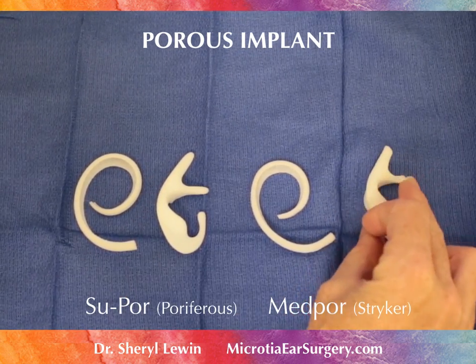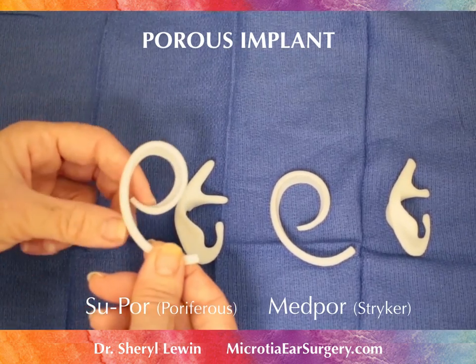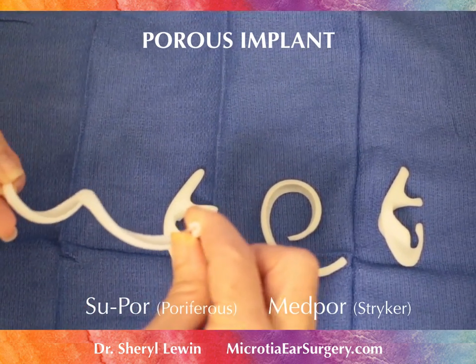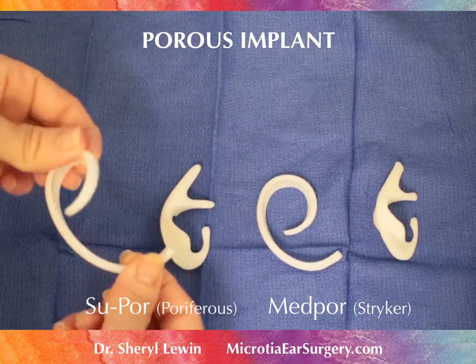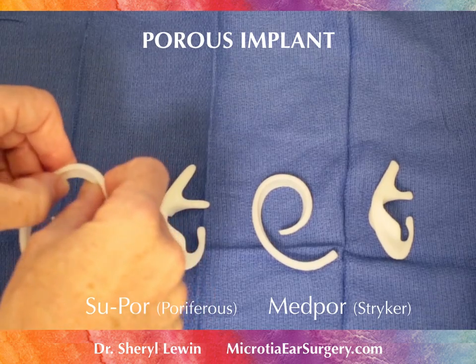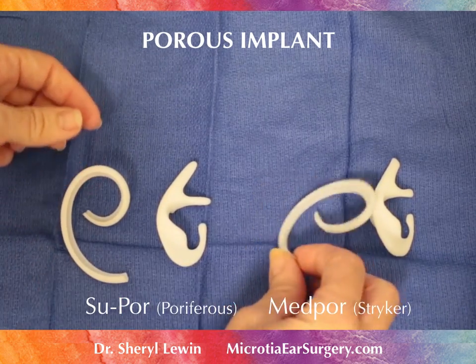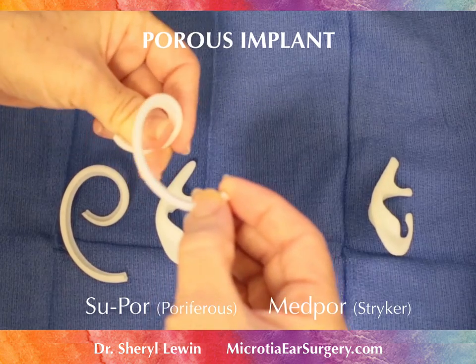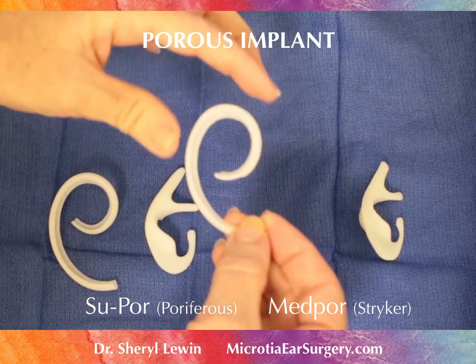In addition, what you might notice is that the SUPOR rim is very flexible. You can twist it completely, and it can hold a shape and be manipulated so that you can create and sculpt this rim. The MEDPOR implant, although it can twist, is restricted, and if you twist more, it might fracture.